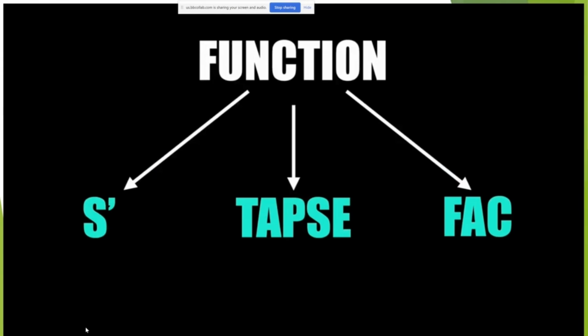The ejection fraction doesn't work as well for the RV because of the shape of the RV. It's not a nice concentric cone. The RV is this weird kind of kidney basin. You know, the kidney basin that you have your patients throw up in. It's kind of that shape. So it's difficult to get a good ejection fraction. So we do these things. We do S prime, which is systolic excursion velocity, and TAPSE. This is the easiest one, so I'd focus in on this one. You can also do fractional area change.